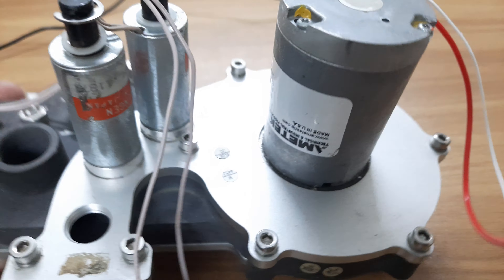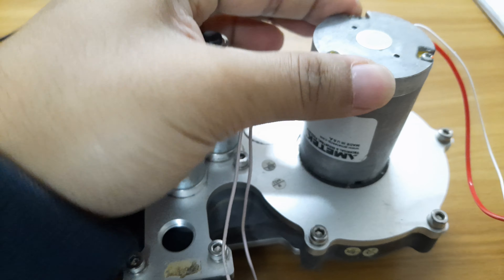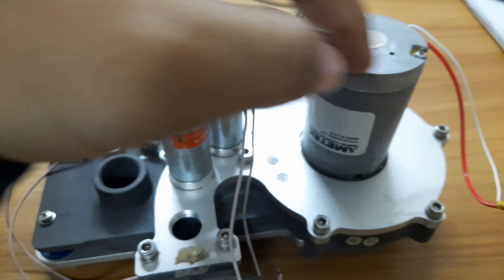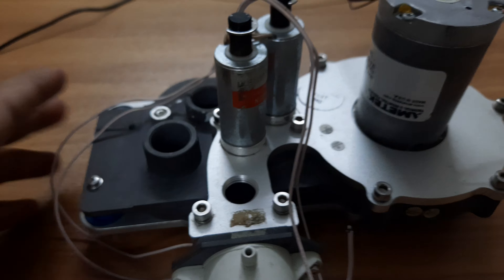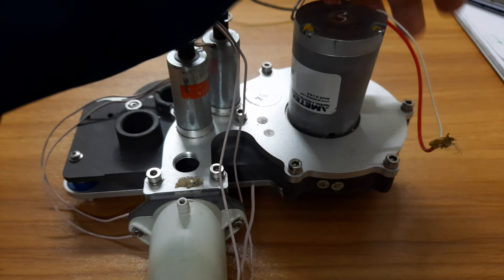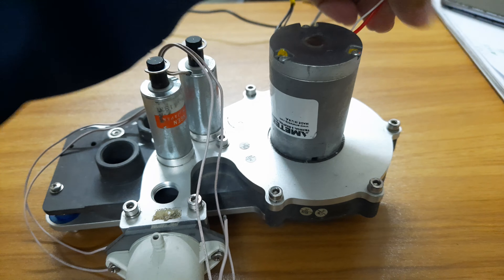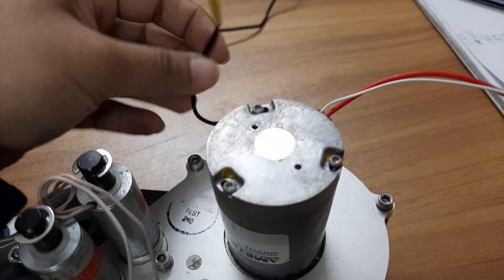This motor has a built-in encoder so that it can count the RPM of the motor, allowing the control algorithm to easily read the motor RPM. Here you can see the kind of connection.